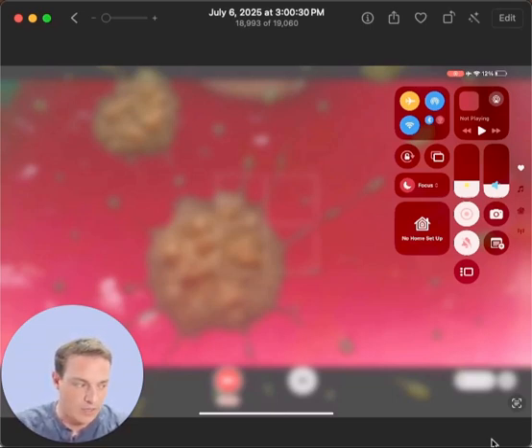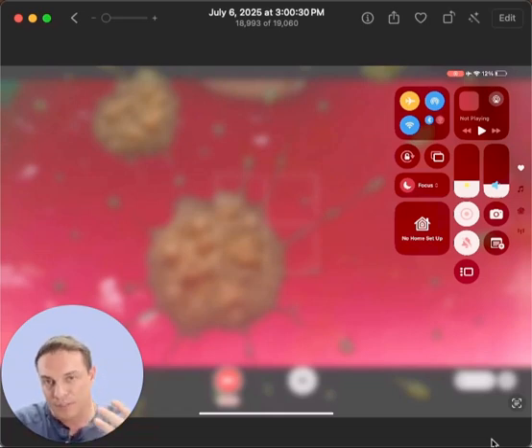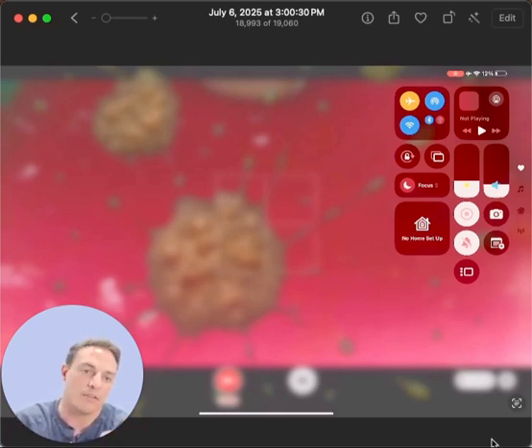The same as with marksmanship, with shooting, right? If you're not holding that weapon, if you're not doing dry fire exercises, the same thing translates over into any procedure, right? So this gives you that sort of dry fire, so to speak, situation, a simulation, right? But being able to build upon that and not have to require thousands of dollars of equipment, and then providing feedback to the learner where maybe there's not someone there providing that skilled feedback.